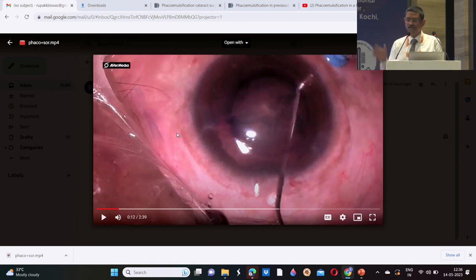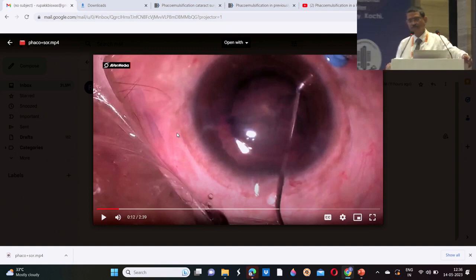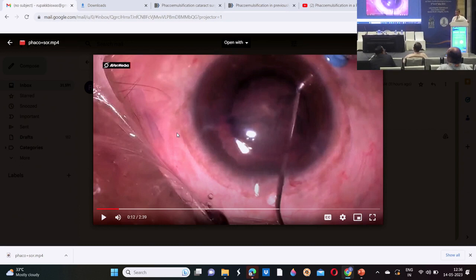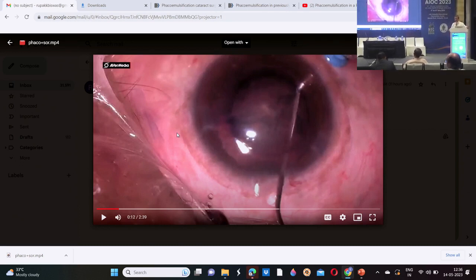And always in a vitrectomized eye, with or without silicone oil, low parameter phacoemulsification is what we should look for. Slow phaco. Exactly. And preoperatively, for the biometry with silicone oil, the viscosity of the silicone oil needs to be fed into the biometer so that we get adequate biometry.